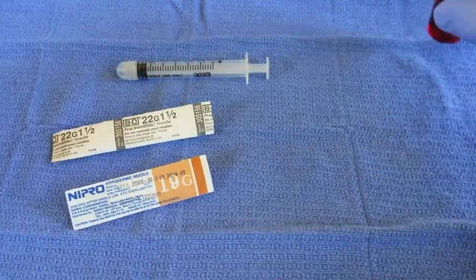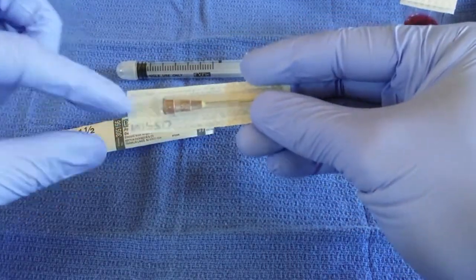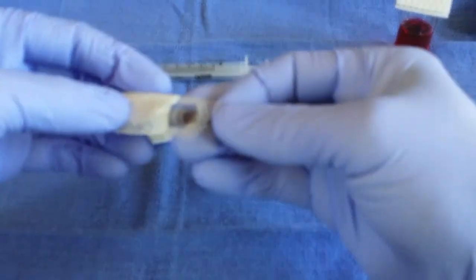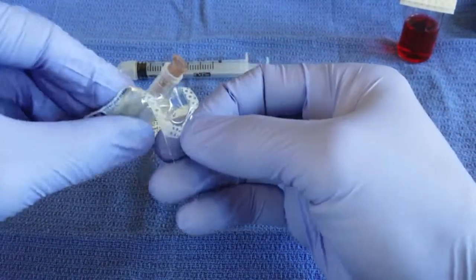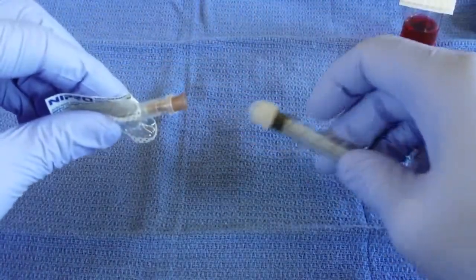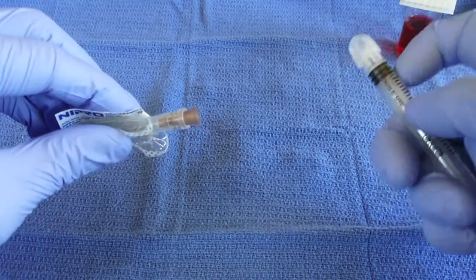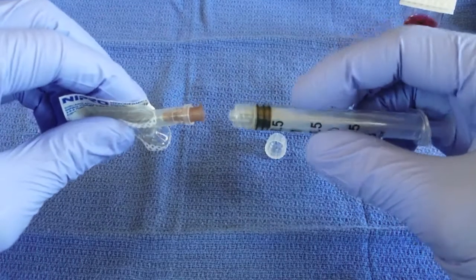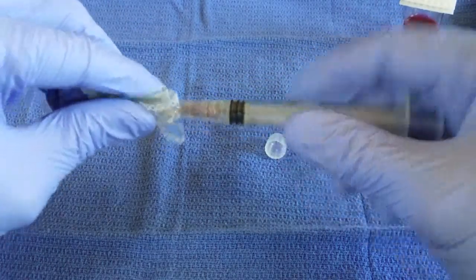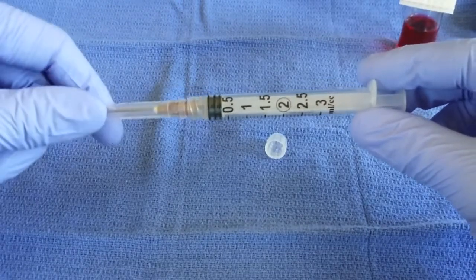We'll start by opening our 19 gauge needle. When we flip this over, you can see here's the tip of the needle and here's the hub of the needle. We want to make sure that when we're opening this, we don't touch or contaminate the hub of the needle — just peel back the wrapping. Next, we'll put this onto our syringe. Remove the cap, and try not to touch the end of the syringe where the hub is going to be connected. We want to make sure we keep both of those parts sterile. Now we can screw the needle onto our syringe and remove the wrapping. We now have our 19 gauge needle on our syringe, ready to withdraw our B12.